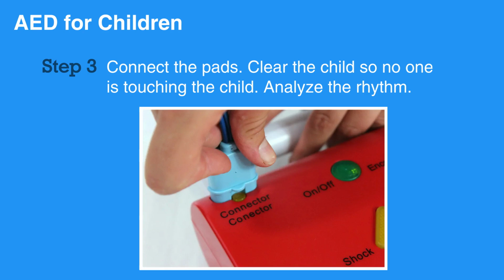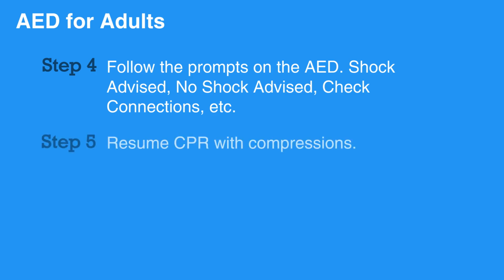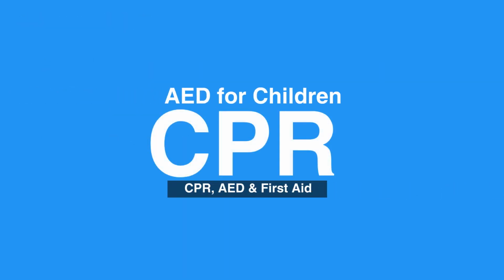Analyze the rhythm. Follow the prompts: shock advised, no shock advised, check connection, etc. Resume CPR with compressions. This concludes our lesson on AED for children.